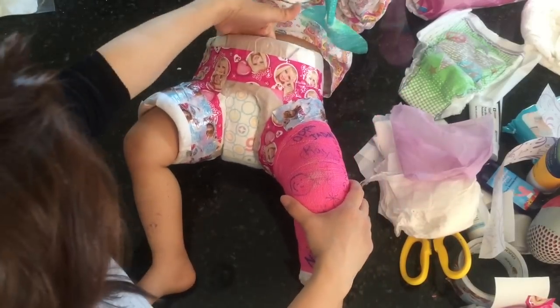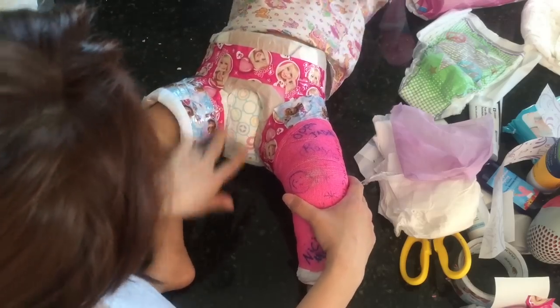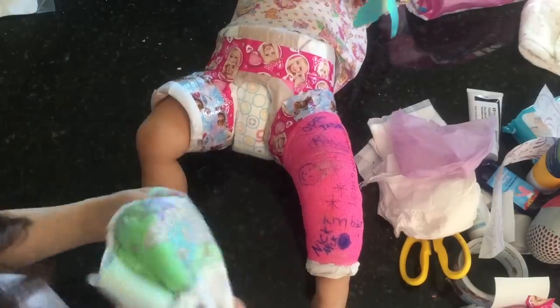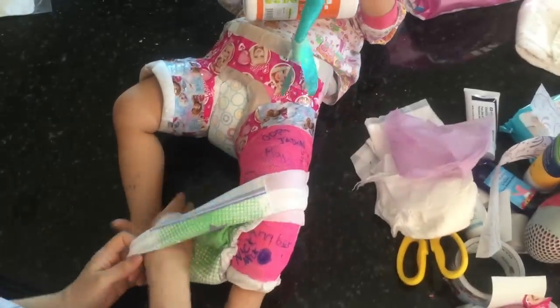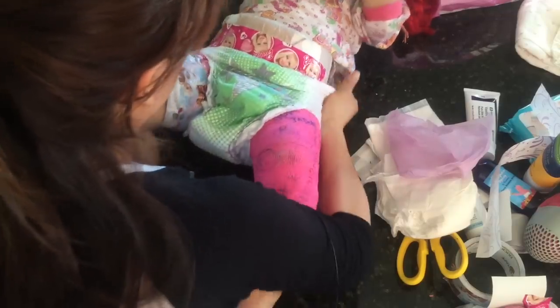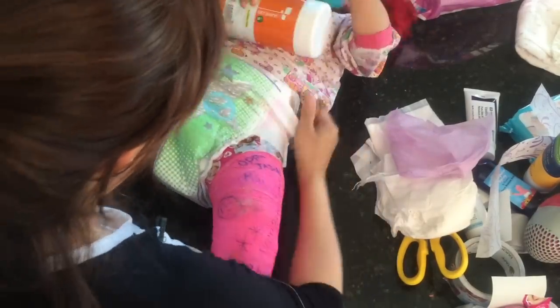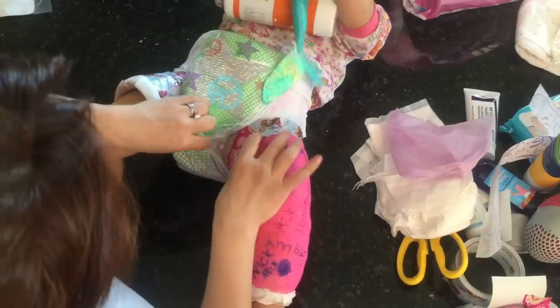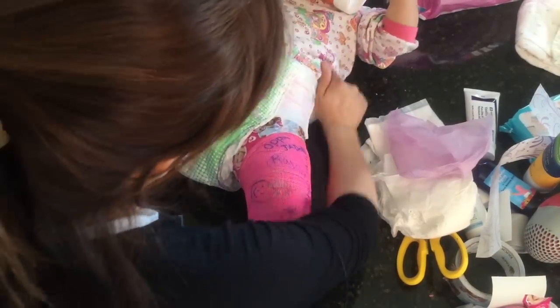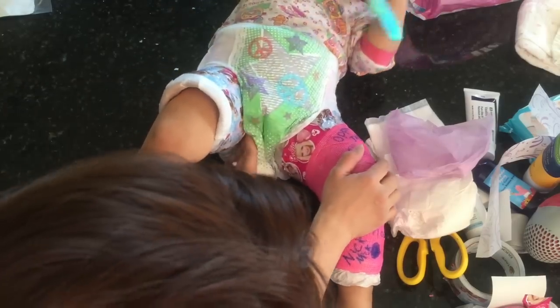Sometimes she'll put her hand in and push the diaper out, so that's when the large kids' overnight diaper goes over everything — a double diaper. The good thing is that if the outer diaper doesn't get wet you can reuse it multiple times. Sometimes she'll leak so just put it in there and adjust.